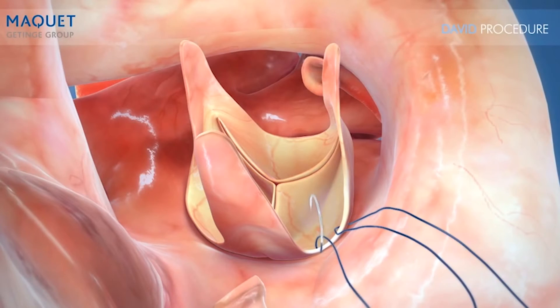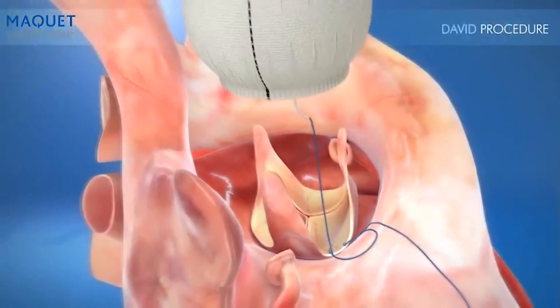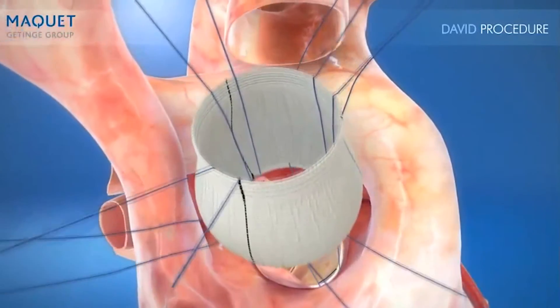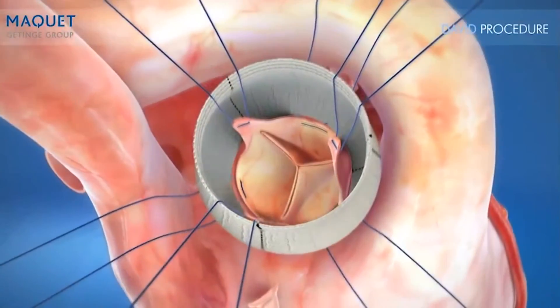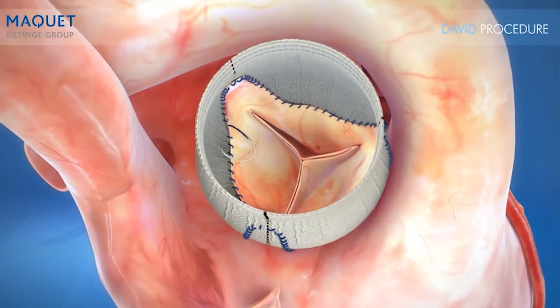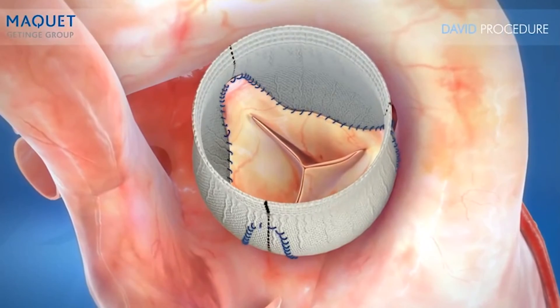Interrupted sutures around and below the circumference of the annulus are then passed through the base of the CardioRoute graft. At this stage, CardioRoute facilitates optimal anastomosis when the commissures are retrieved from within the graft and secured to the graft at the new sinotubular junction.